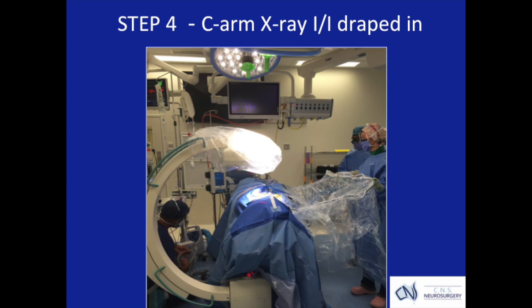This image shows the imaging device being brought into the operative area with sterile draping. That device will be used to guide the prosthesis, which is trialled and then inserted.